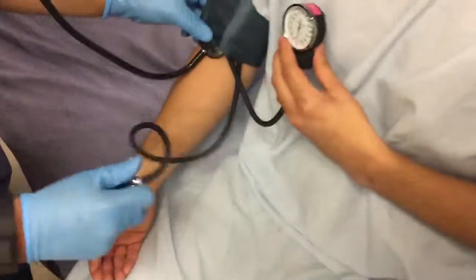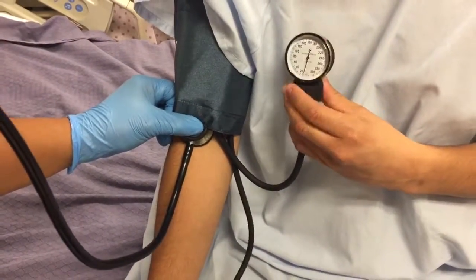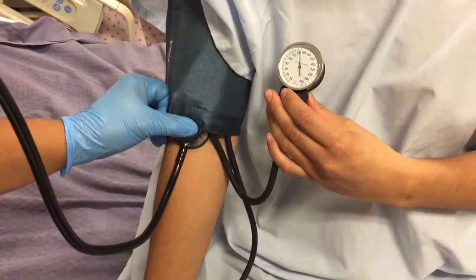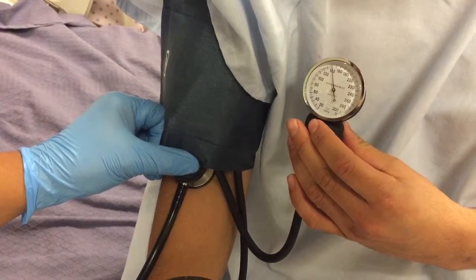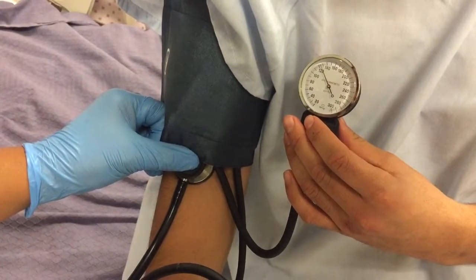Okay. I want to make sure that we gather the proper equipment. So I have my blood pressure cuff, my heart rate monitor, the inhaler that was prescribed, and the spacer. Now I'll be washing my hands before I go.